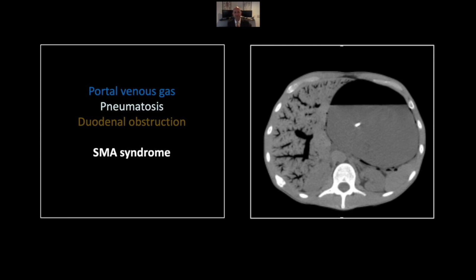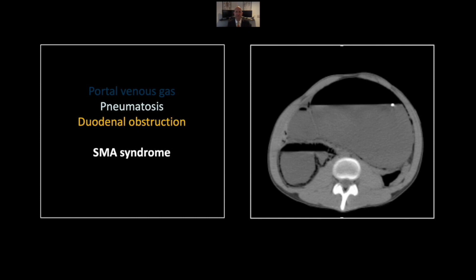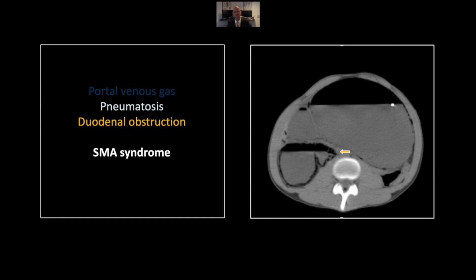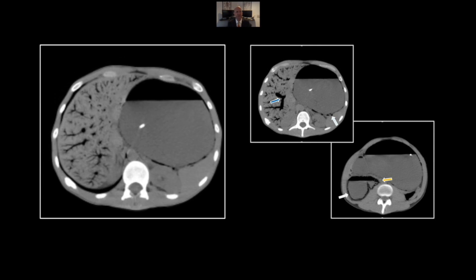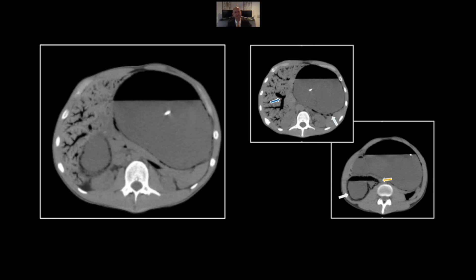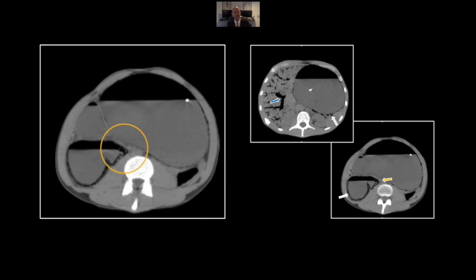Our next case is an SMA syndrome with bowel ischemia, pneumatosis, and portal gas. Here you see the portal venous gas extending to the periphery of the liver, as is typical, and pneumatosis of the gastric wall. More inferiorly, the diagnosis is clear when you see the pneumatosis affecting the duodenum, and also its obstruction right in that third portion of the duodenum, typical of SMA syndrome. Note the marked gastric distension. Note the patient is cachectic as well. There's the portal venous gas and duodenal pneumatosis and obstruction.